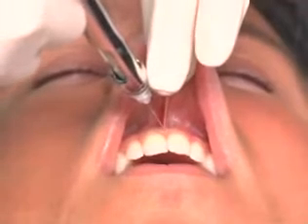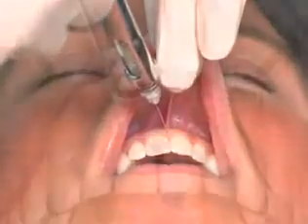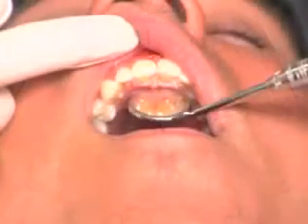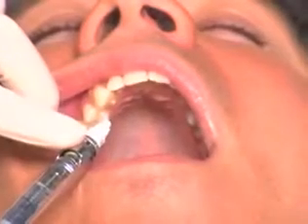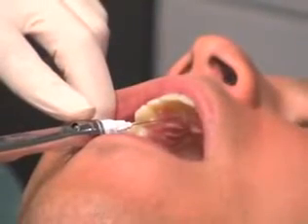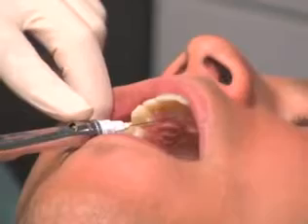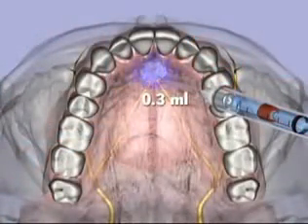The second injection is an infiltration into the now-numb papilla between the two central incisors. Local anesthetic is administered as the needle is advanced until blanching is noted on the palatal soft tissues. The third injection is a traditional nasopalatine nerve block in which the needle is inserted into the soft tissues just lateral to the incisor papilla. The needle is advanced through soft tissue until bone is contacted, and following negative aspiration, 0.3 mls of local anesthetic is administered.